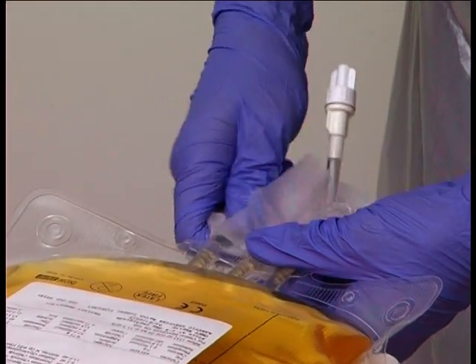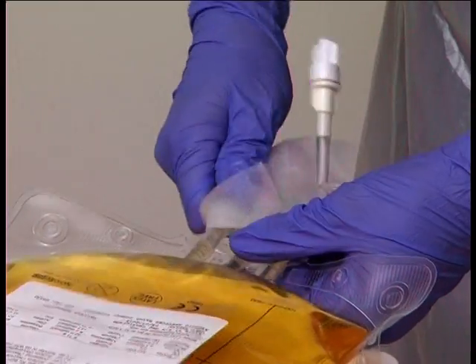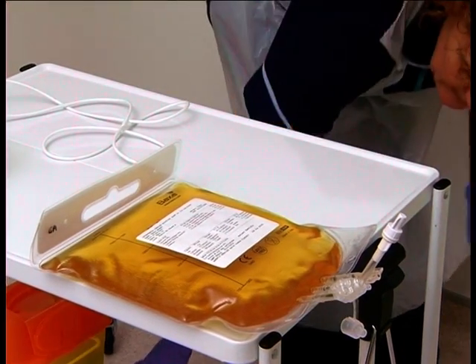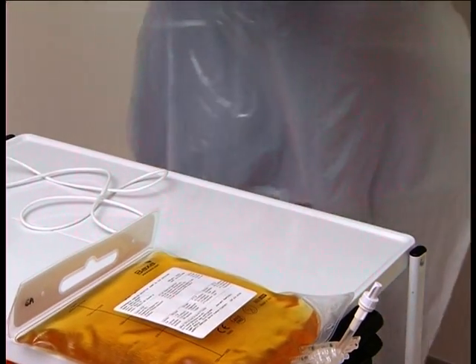Leave this to air dry for at least 30 seconds, and longer if it looks wet. If necessary, move the bag so that the cleaned connection will not be at risk of contamination whilst you carry out the next part of the procedure.